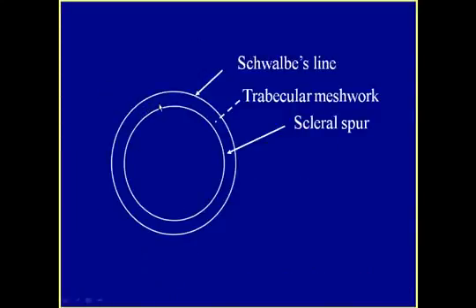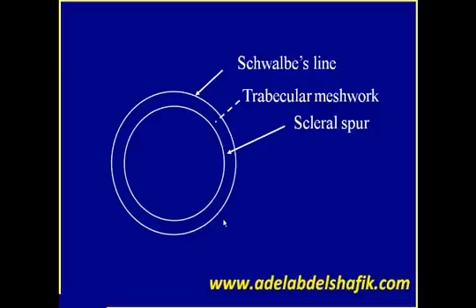I just make a drawing here. This would represent the last roll of the iris. So if I draw it here, trabecular meshwork is partially visible. If I draw it here, the whole trabecular meshwork is visible. If I draw here, the trabecular meshwork is not visible. So I just make these two drawings and start to use a third line with my hand to tell which part of the angle the trabecular meshwork is visible and which part the trabecular meshwork is not visible.